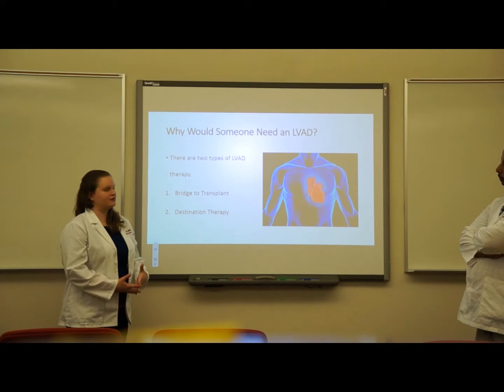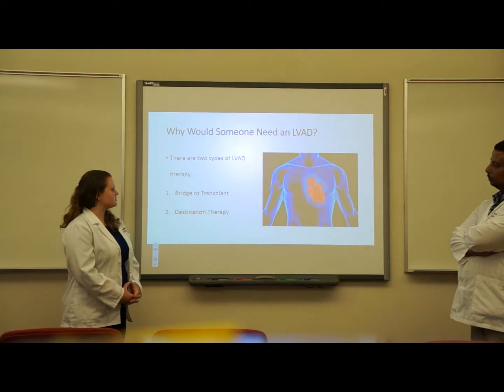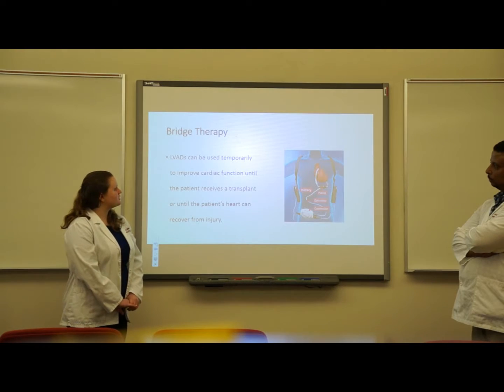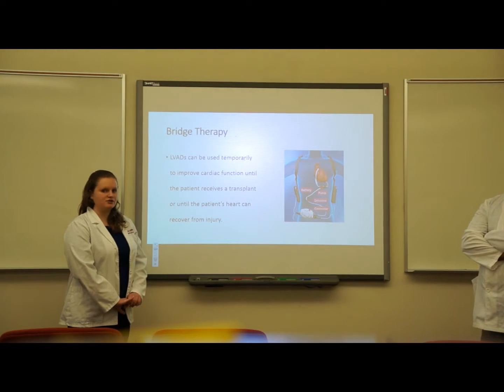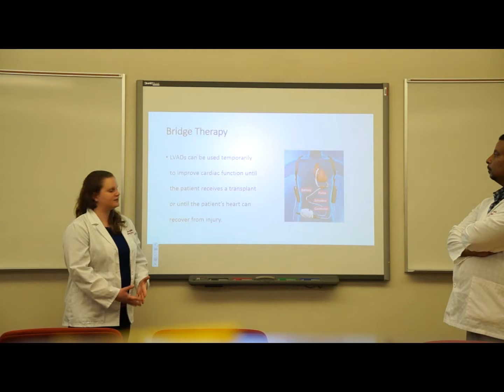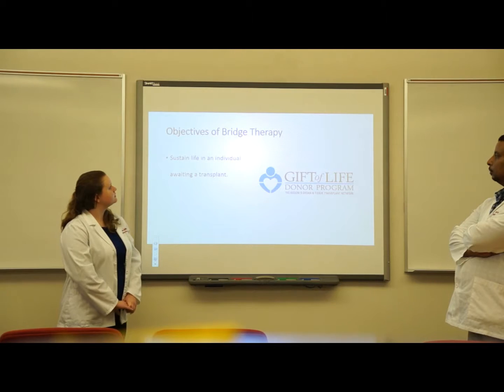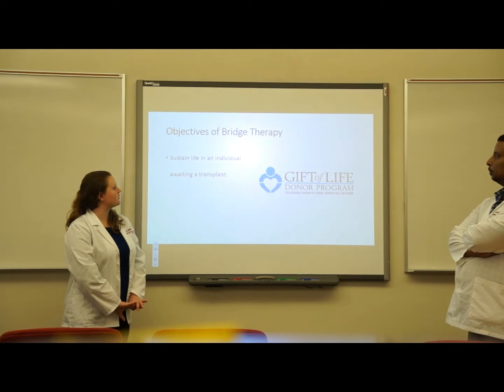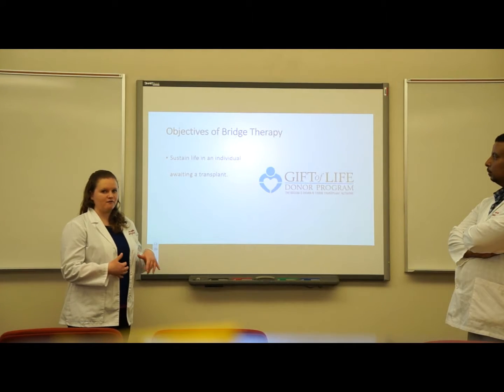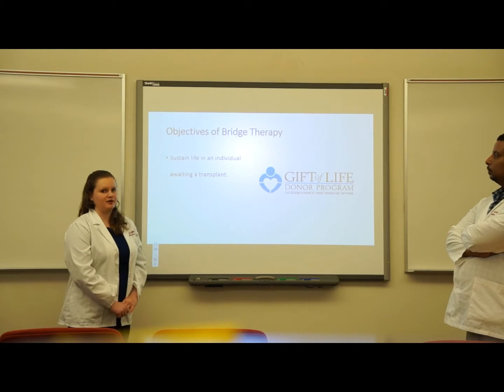Why would someone need a left ventricular assist device? There are two types of LVAD therapies, bridge to transplant and destination therapy. The bridge therapy are temporarily inserted LVADs that support patients who are either getting a heart transplant or whose heart needs time to recover from injury. The objectives of bridge therapy are to sustain life while the patient's waiting for a transplant or while the patient's recovering from injury.